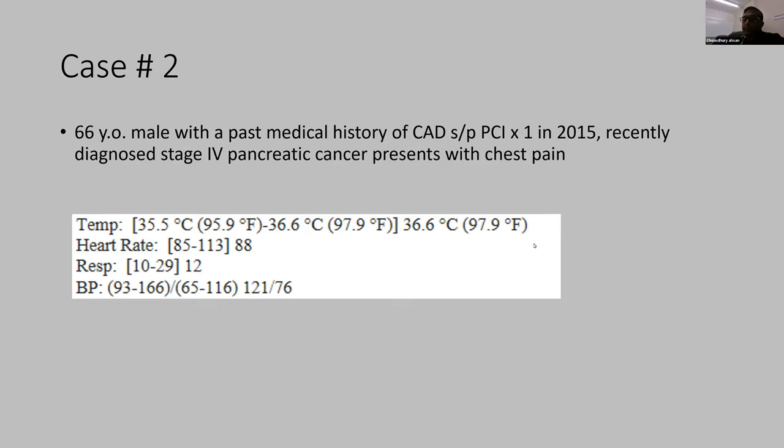Actually, syncope is a blessing, because in that case, you probably would not even do HV interval. You just put a pacemaker. Exactly. Trifascicular block with syncope. Yeah. You also have to look at the clinical scenario, but most likely it is intermittent AV block.